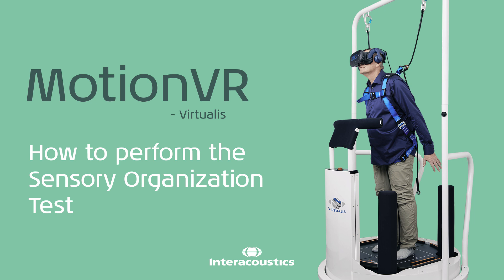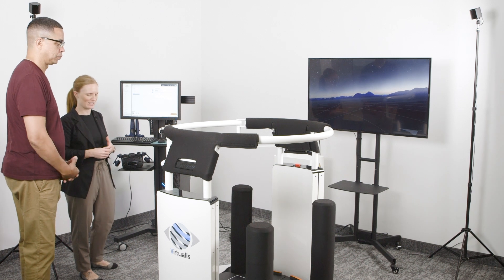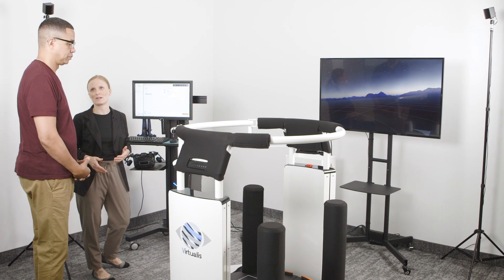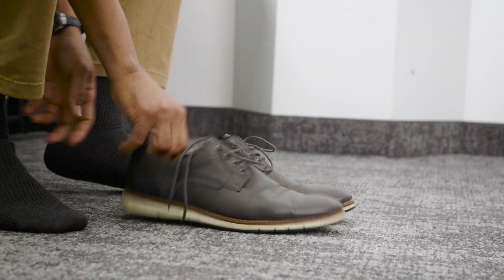This is how to perform the sensory organization test on the Virtualis Motion VR. You will be performing the sensory organization test. Instruct the patient that their goal is to stand still during the assessment. Have the patient remove their shoes for standardized somatosensory input.